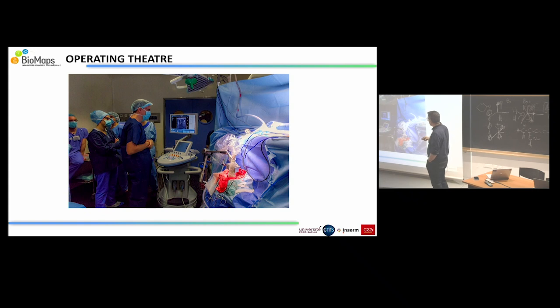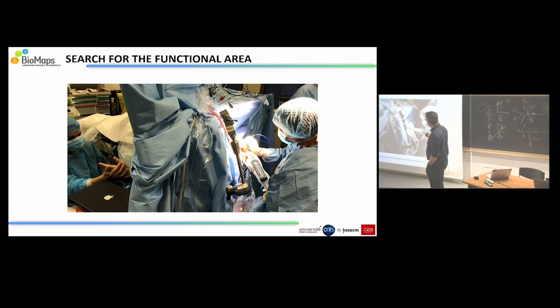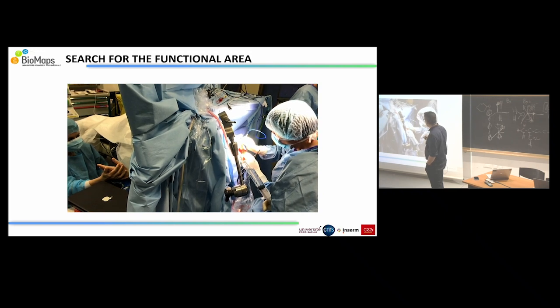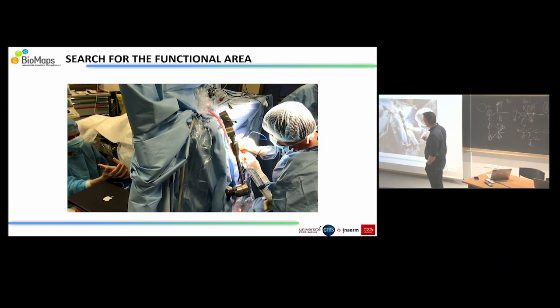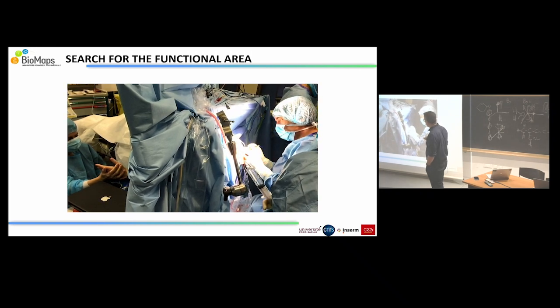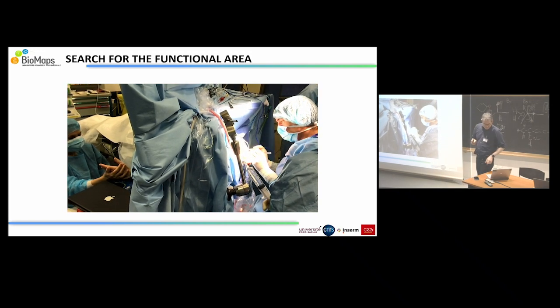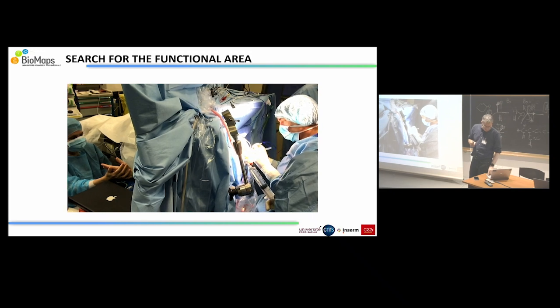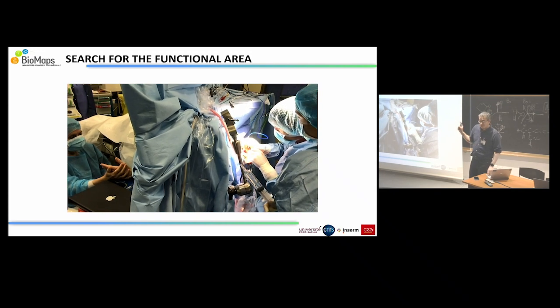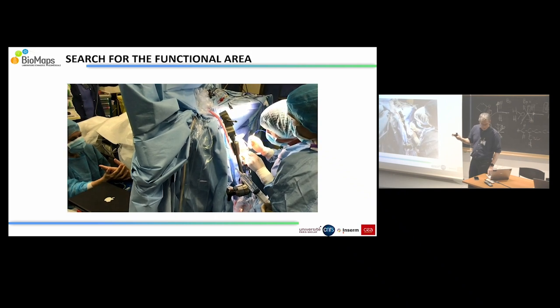So here you have a metal arm with a probe placed on the head of the patient. This is an example. So the neurosurgeon is here. He has an electrical device and he will send some electrical pulses at the surface of the brain. You have a speech therapist who speaks with the patient, who is awake during the surgery. Just after, this is a surgery picture, so don't worry. Okay, it's normal. You will see some blood.